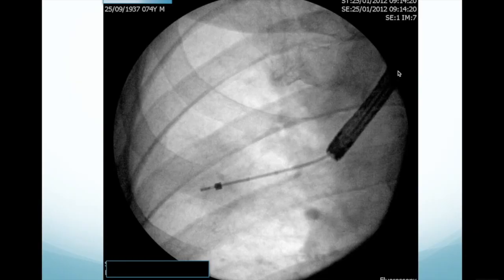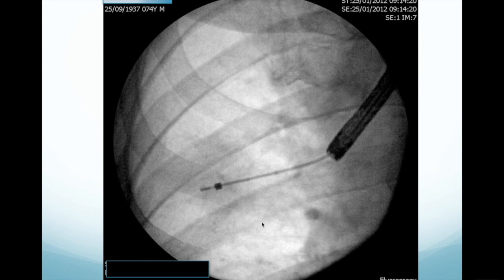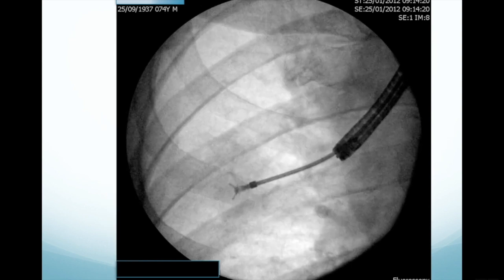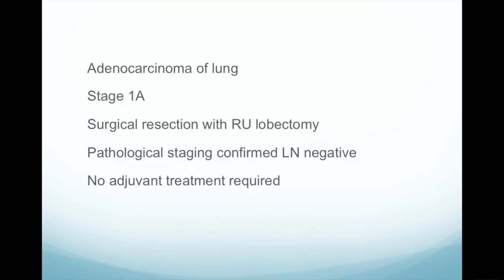This is the fluoroscopic image. Here we can see the bronchoscope, and coming out of the tip of the bronchoscope is the radial EBUS ultrasound within the guide sheath. This is the metal tip of the guide sheath so you can see where it is, and this is the tip of the ultrasound. On the fluoroscopy we can't really see the nodule, so we know we're in the right place because the ultrasound showed us we're within the lesion — if we were relying on fluoroscopy only, we would not know that. Now we've removed the ultrasound from within the guide sheath and replaced it with biopsy forceps. You can see the biopsy forceps open, and we're about to take a biopsy from within the lesion.